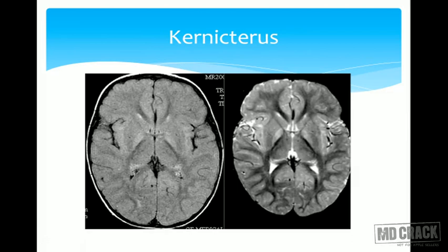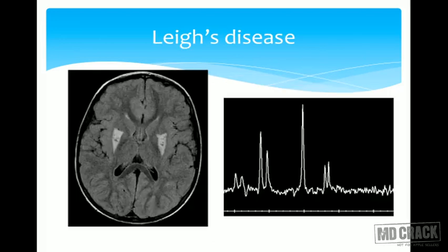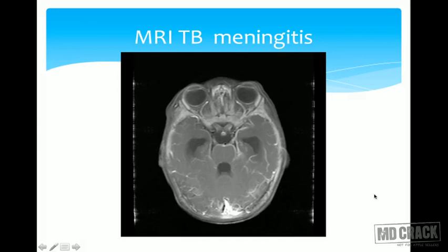Kernicterus shows bilateral basal ganglia abnormalities — seen here in a child with elevated bilirubin at three months. Leigh's disease, another metabolic disorder, shows T2 hyperintensity within the putamen. MR spectroscopy provides a graph of metabolites that helps determine the disease process.